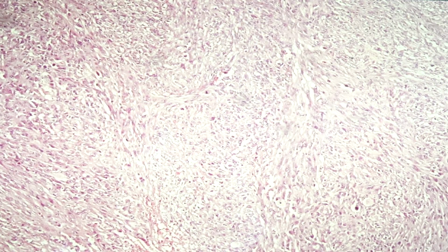These are composed of alternating patterns of atypical smooth muscle fibers, circular, longitudinal, circular. They would be positive for desmin and smooth muscle actin.